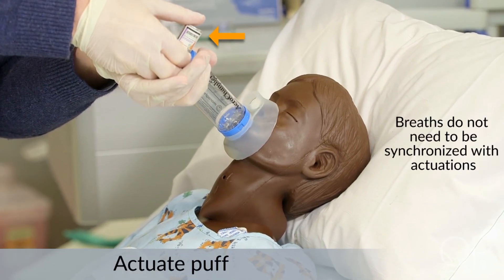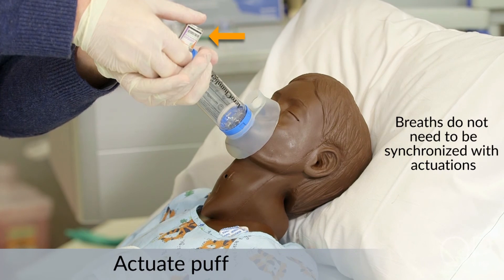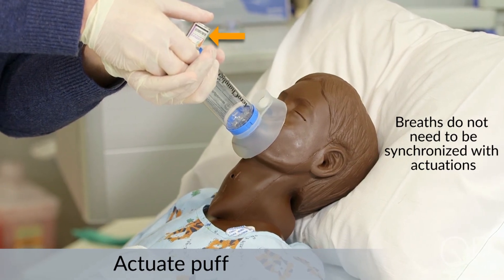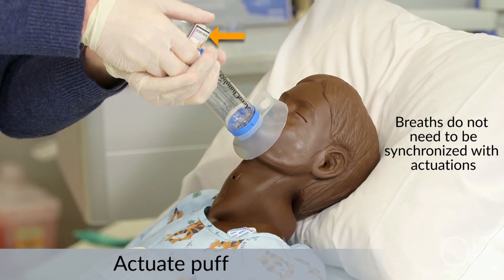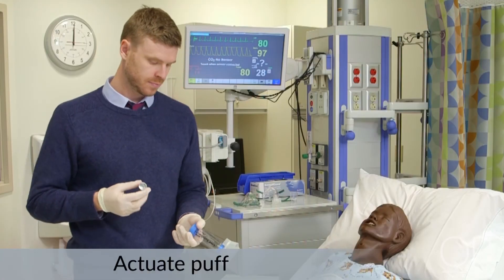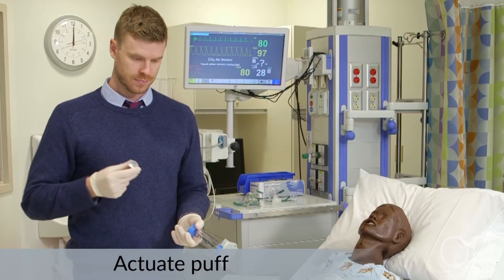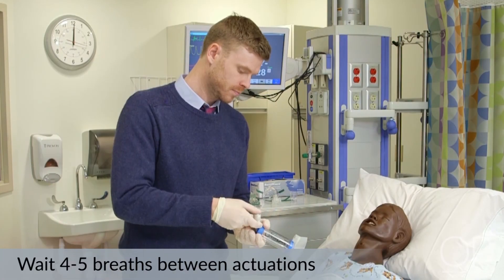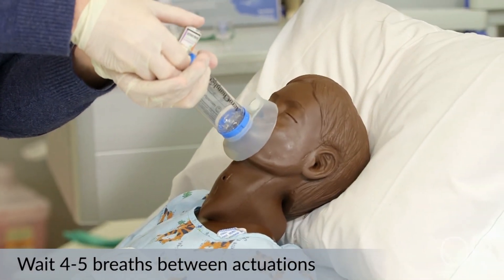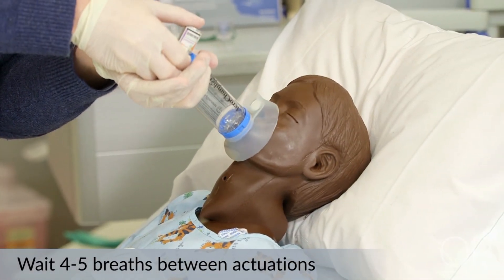It's not essential for the patient to synchronize breathing with the canister actuation since we're using a chamber that helps to ensure the medication is delivered on demand. I'm going to shake for another 30 to 40 seconds after that actuation before we give our second dose. I wait 4 to 5 breaths between actuations to make sure that the patient inhales all the medication in the chamber if possible.